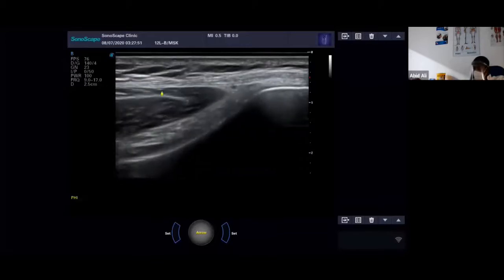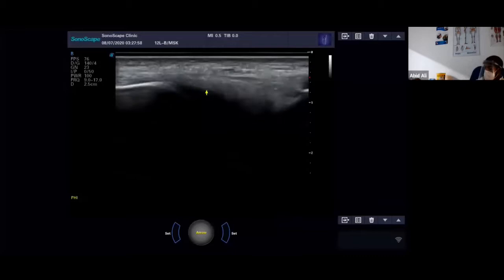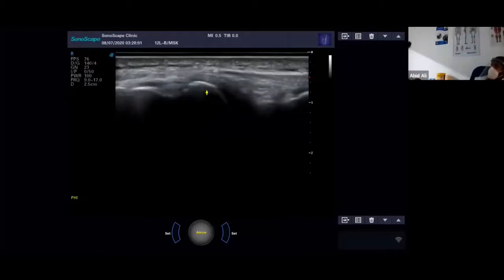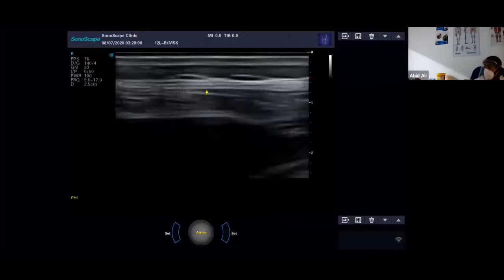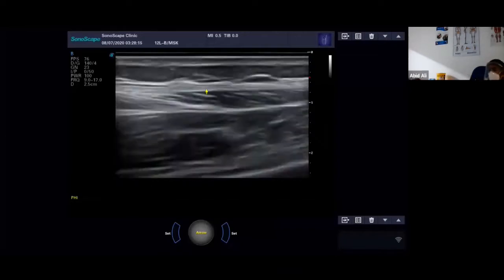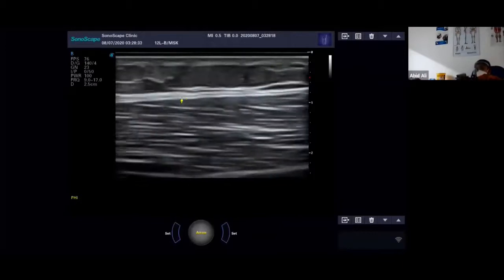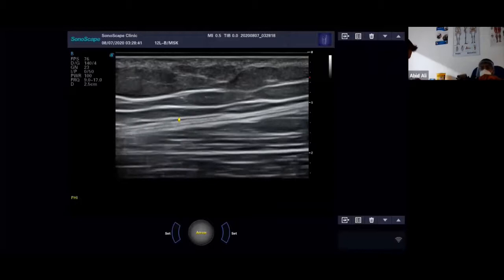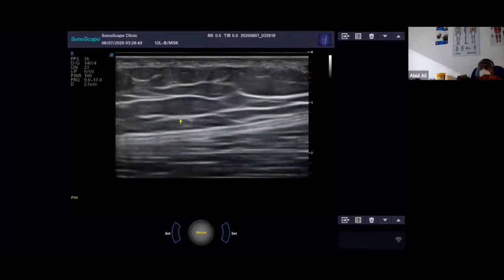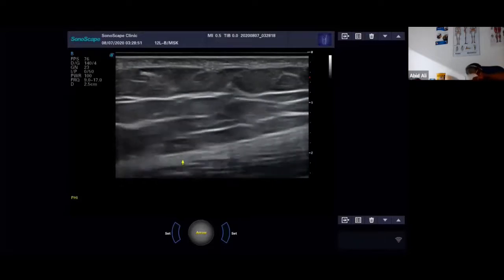So this is a bit of vastus lateralis here. I suppose you could show that all the way up to the trochanter if you like. Yeah, you can do that, but it goes very thin, so you're literally just following a thin line up. You need a lot of gel. You can follow it right to the lateral hip, the greater trochanter. We'll probably cover the hip in another session, and then it splits into tensor fasciae latae and gluteus maximus and things like that.